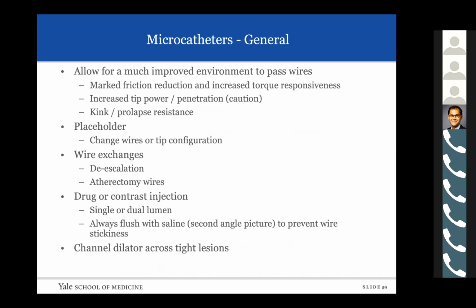Microcatheters are great. They allow a much improvement in your ability to pass wires. They greatly reduce any friction. They're really technologically unbelievable, as are the wires that we use. They're basically polymer jacketed on the inside to reduce friction. These should be flushed before to increase that.